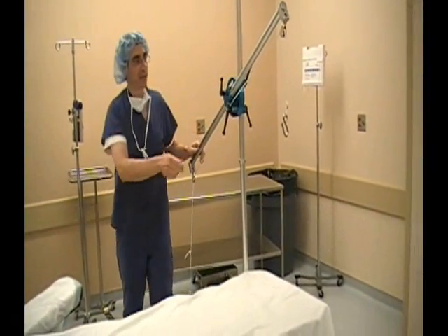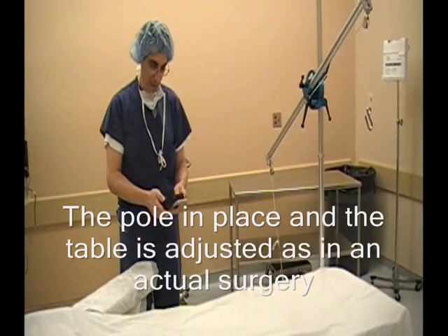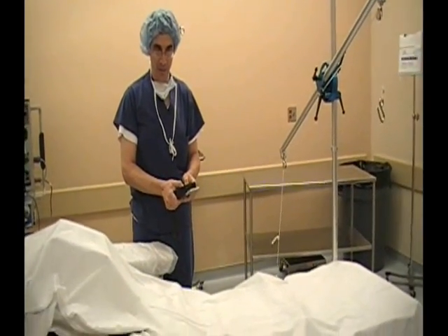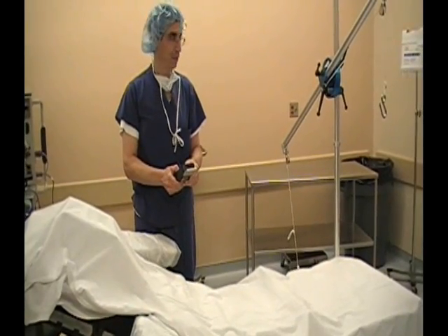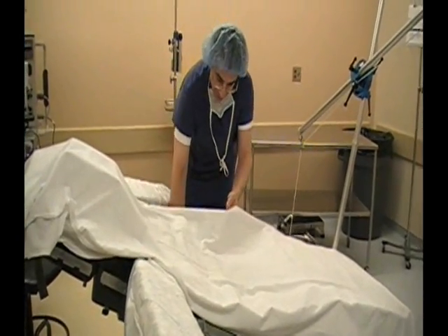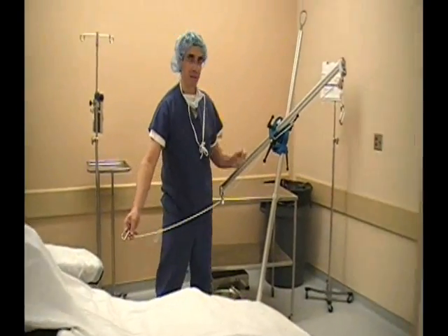Now, if you want to put the table into a beach chair position, bring the back up and the leg down. And in this manner, the patient's arm will be applied in traction from here, and the weight will be added on that end.